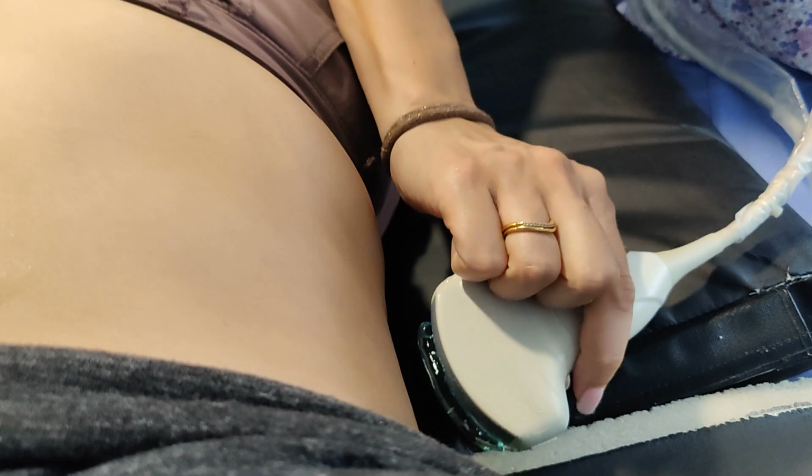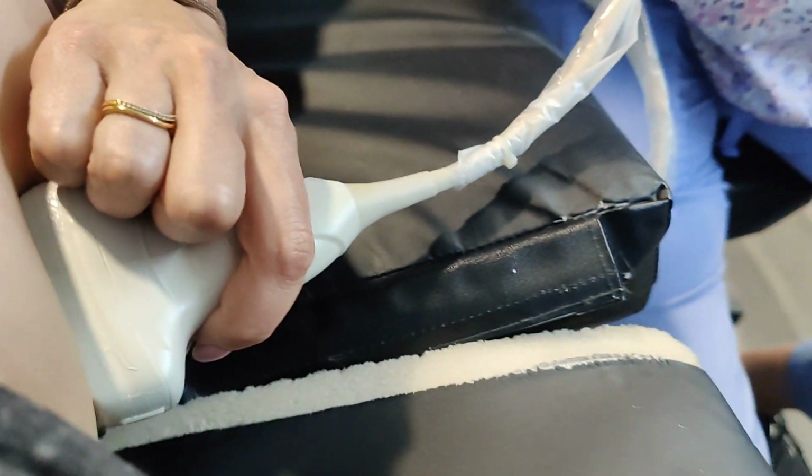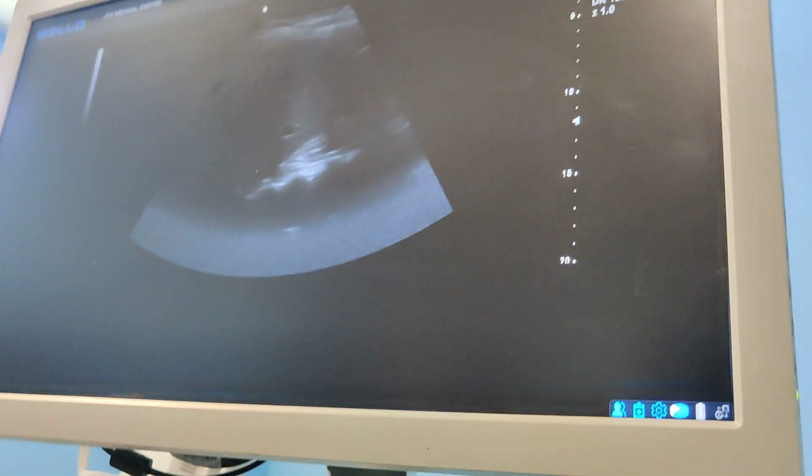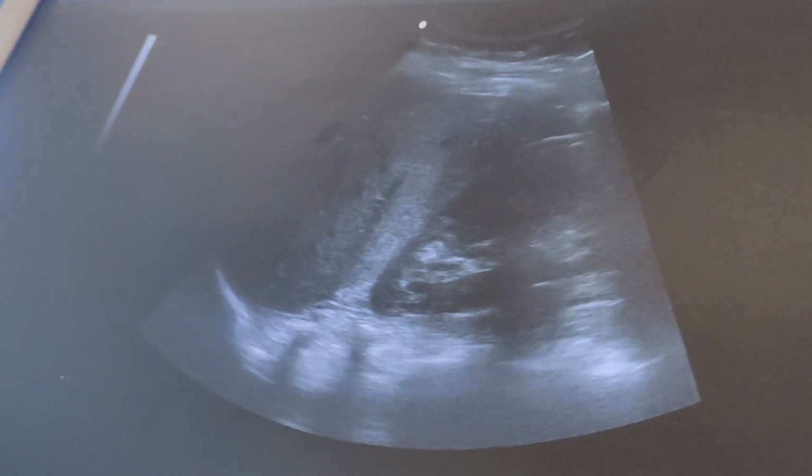All right. For the next view in sagittal, I come intercostal to the patient's rib space on the side. So this is going to be my window where I'm going to be scanning sagittal for the right lobe. If you only scan from the epigastric or xiphoid area, you'll miss a lot of pathologies that are more in the right lobe. So you want to be sure that you come intercostal as well. For measuring, some people measure here. Where I was trained, we measure at the liver-kidney interface. So it kind of depends on where you're working.